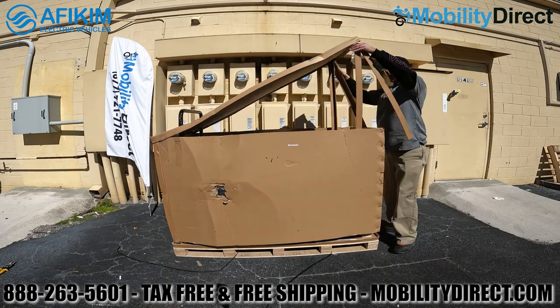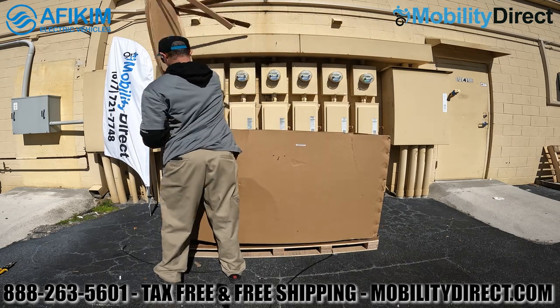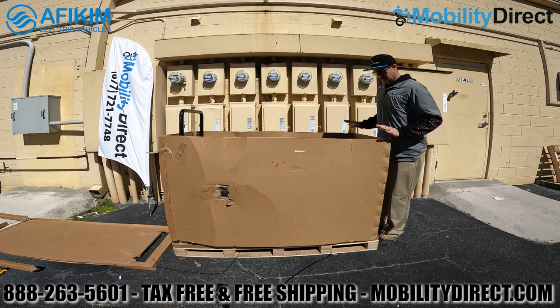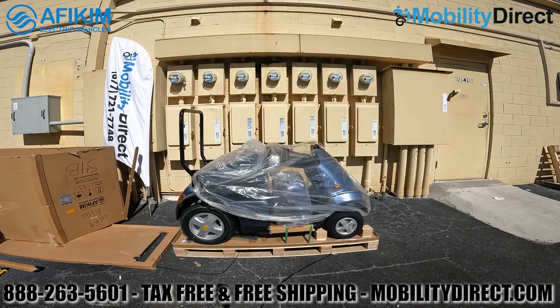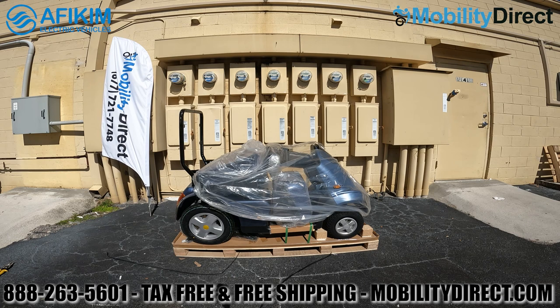The scooter will arrive fully assembled on a pallet with a cardboard box completely encased around it. All you need to do is lift the box straight up as shown in the video. Cut the pallet straps, remove the lid, and shimmy the box upward. It helps to have two people, though one person can manage if needed.